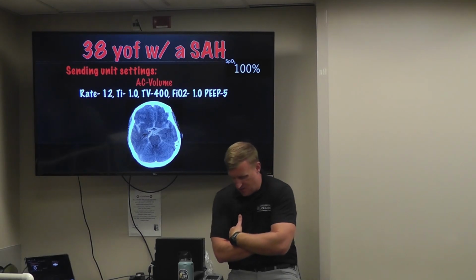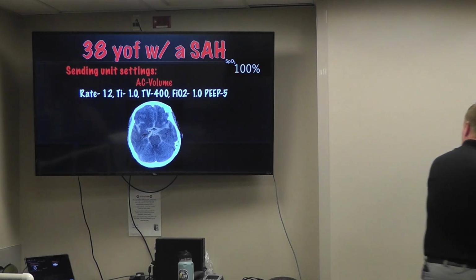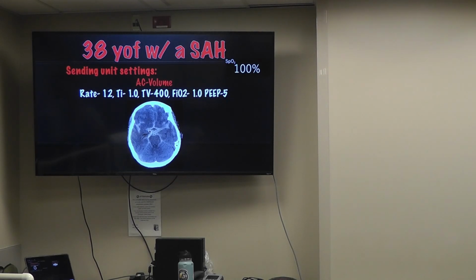So we go out for this 38-year-old female with a subarachnoid. Right, subarachnoid, yeah. We walk in. She's on a rate of 12, a 1 second I time, a 400 cc tidal volume, 100% FiO2, and 5 of PEEP. Okay? She's sat in 100%. A SAT of 100% is the most useless number on the face of the planet. It tells me absolutely nothing, right? It tells me your PaO2 could be anywhere between about 80 or 90 and 480 or 490. So I don't actually want a SAT of 100%. I want a SAT of 98% or 99%.